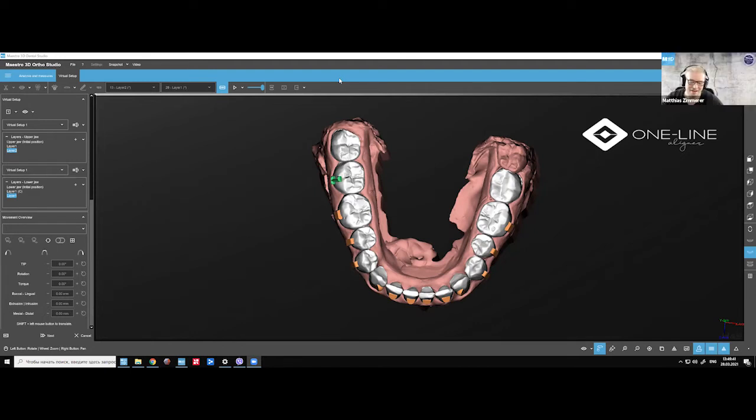Did you try these? Yes, I have tried something else with Keyspin Soft, but Keyspin Soft is too soft. It doesn't work. Oh, did you try this one, the Unis one, or no? No, the Unis one, no.